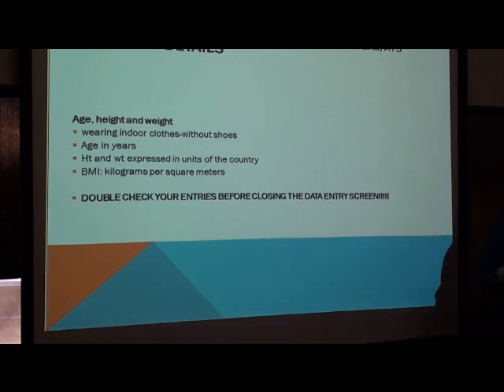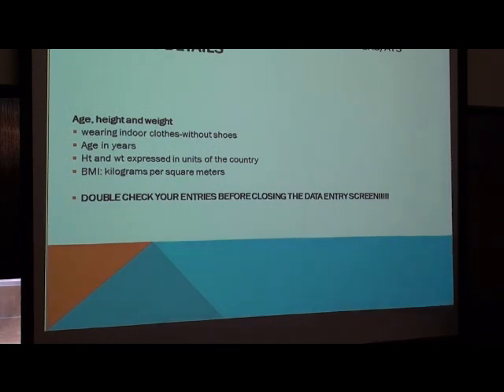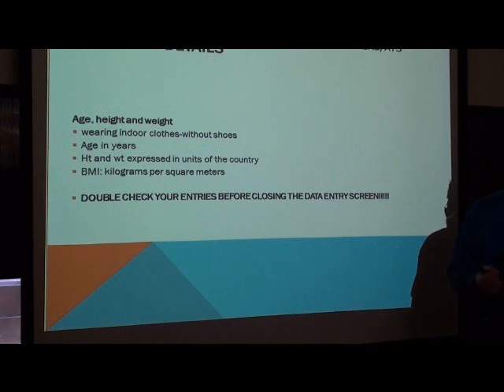The height is always patient without their shoes. Never ask the patient their height. We all know guys are a couple inches taller than they really are. Probably a lot of women too, but guys mostly, definitely. And if you ask them how much heels do they have on there, how do they know how that impacts their height? You really need to get a good baseline measurement. And we've seen variances of 5 centimeters or more in some cases.